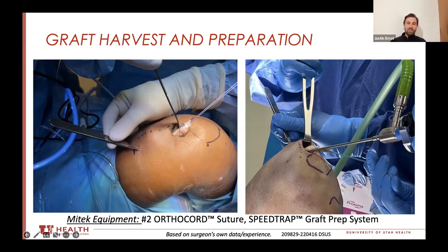It's really such a dynamic procedure that can open up other avenues. So 65 millimeters is the minimum — I try to get at least 70 if I can. The quick math is: we have lots of biomechanical data that says ideally you want at least 15 millimeters of graft in each of your tunnels.